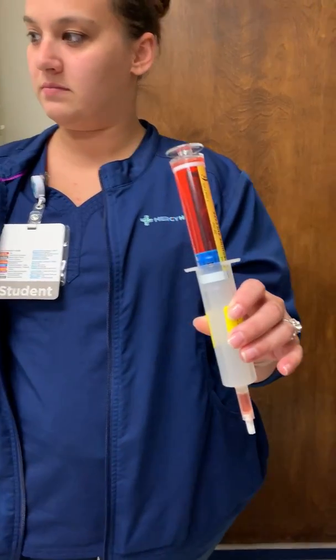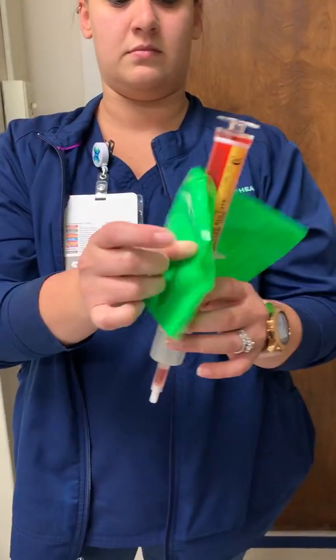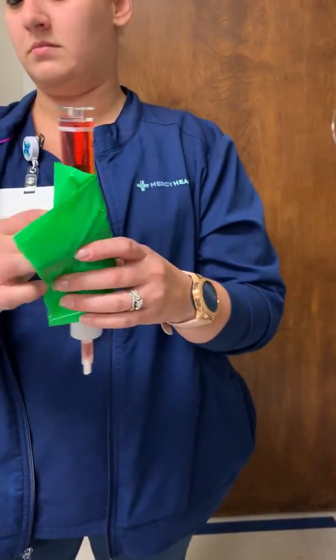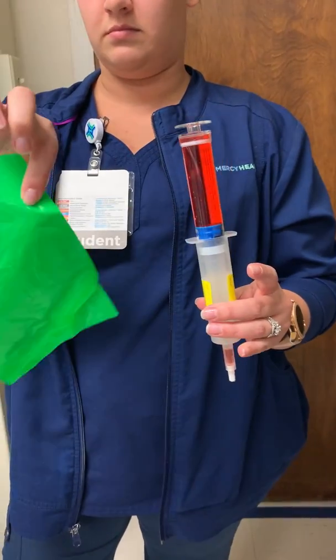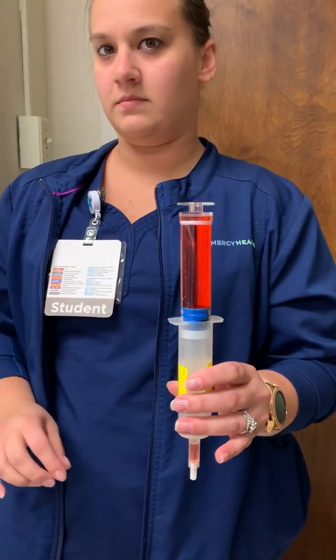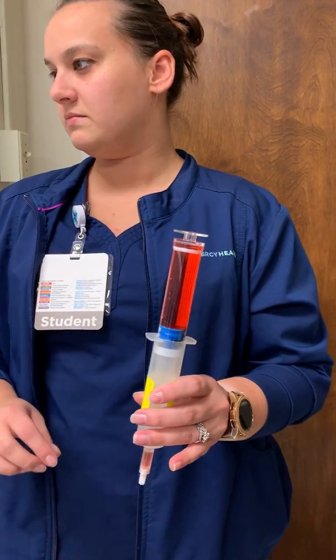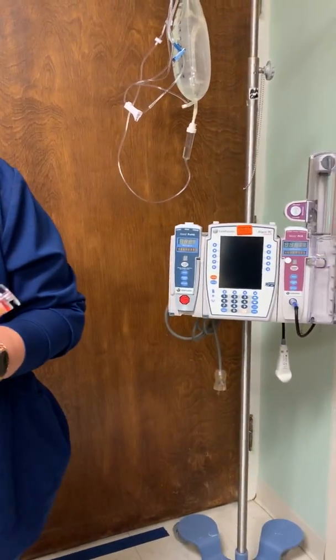If the medication comes from pharmacy, the green bag will surround the syringe. It's going to need removed in order to be scanned. So then the patient's armband and the syringe box or bag will be scanned, and you have to remember the two RNs will be verifying all parts of the process.